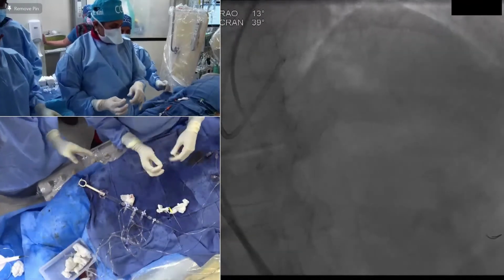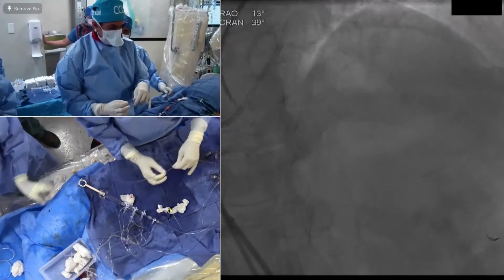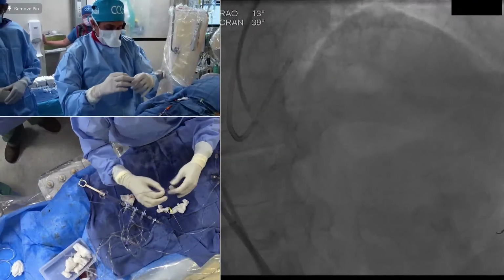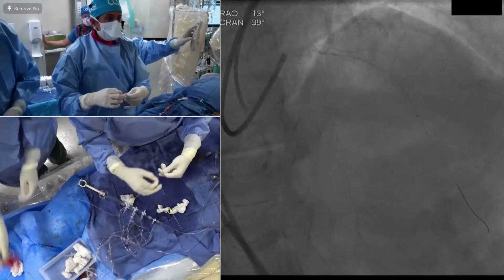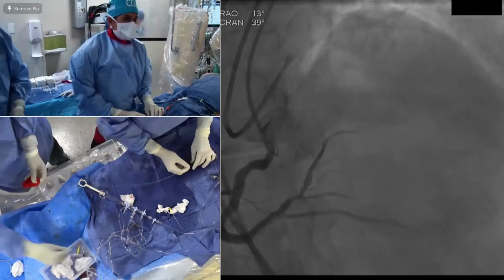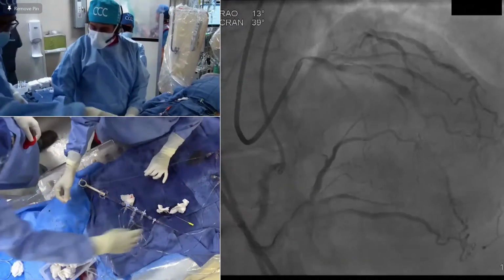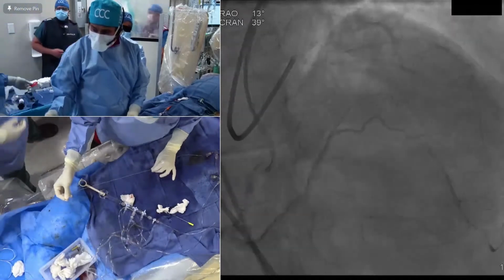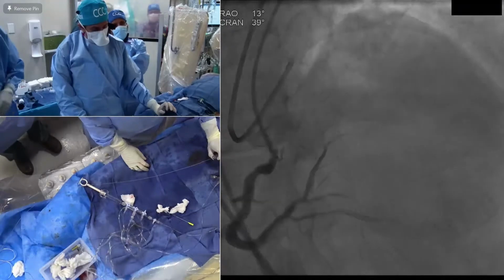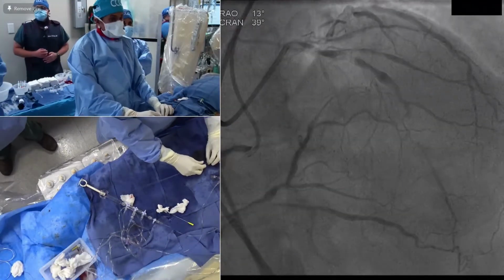Our principle is very simple. If you could not get your fine cross delivered, or it is very difficult, even if it went, go to 1.25. We need a 1.75 proximally anyway. Such a calcific vessel, as you see proximally. So we need a 2-burr approach. This is the case. Overall, step burr, George, as you know, is done in less than 10% of cases. Of the cases which come to us, in 2-3% we use 3 burrs. But this is the 2-burr case.